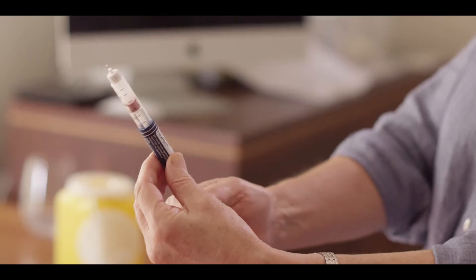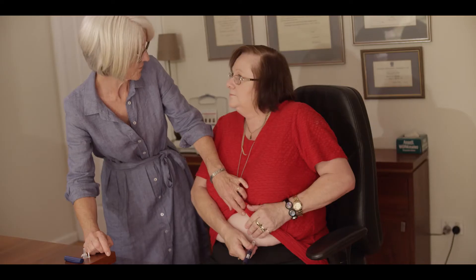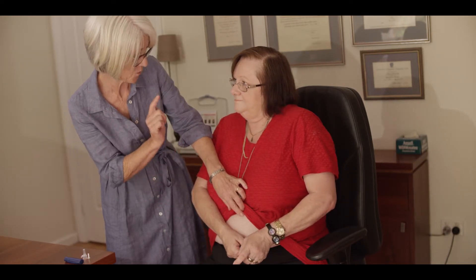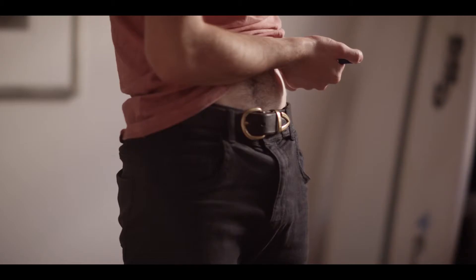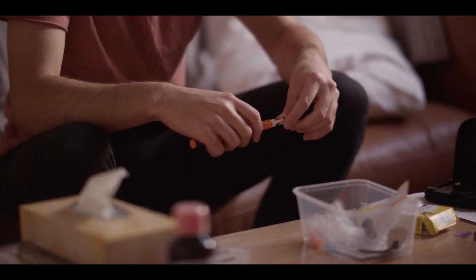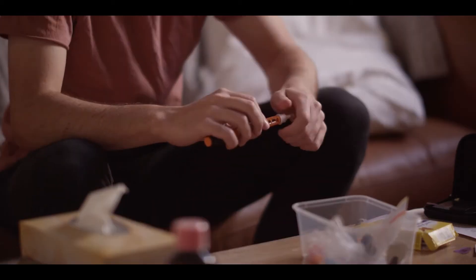Dial up the dose you want to give and select a new place on your skin. Ensure the needle is at 90 degrees to the skin. Press down on the top of the pen directly and don't twist or dial it. Once you've injected the insulin, hold the needle in place for the count of 10 seconds, and finally when you've removed the needle from your skin, dispose of it in a sharps container.